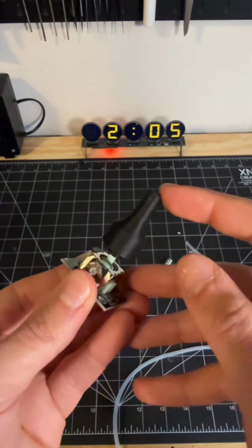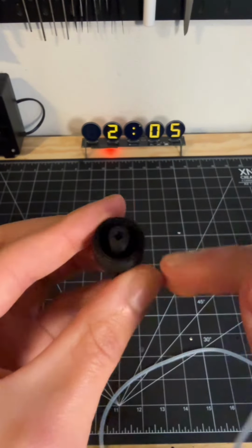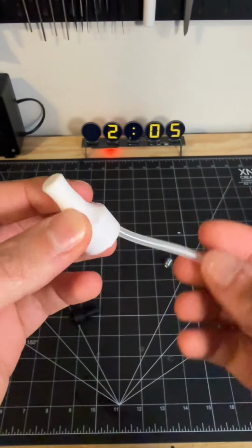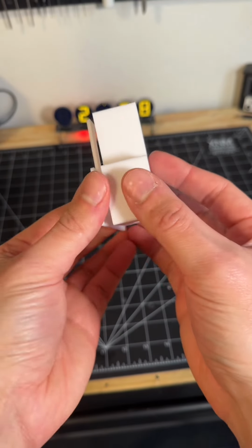So the mouthpiece will fit snugly on top of the joystick, and then the tube is gonna run down the hole here and then come out this gap on the side. I decided to reprint it in white, but you can see here better how the tube goes through the bottom and then has access to the top here. Now I just need a little enclosure for everything. I'll print this out. Got that all printed out.